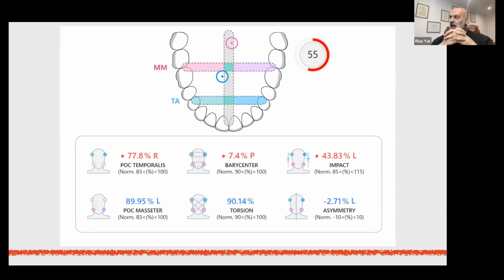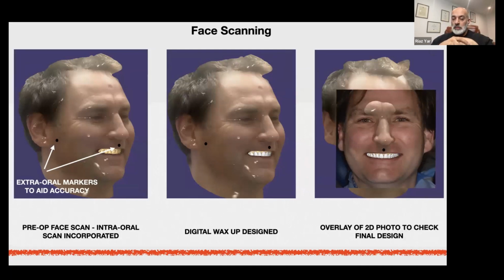The one reason I like TDAN so much is that it simplifies your data collection. You're not reading the micro EMG activity; the data does it all for you. It actually gives you numbers so you can see, and it also tells you what is normal. So you see here, the impact data in this patient should be 85%. His impact data is half, so he is at 50% activity level. So the patient has some problems. And this also relates to his teeth because he has fewer teeth.